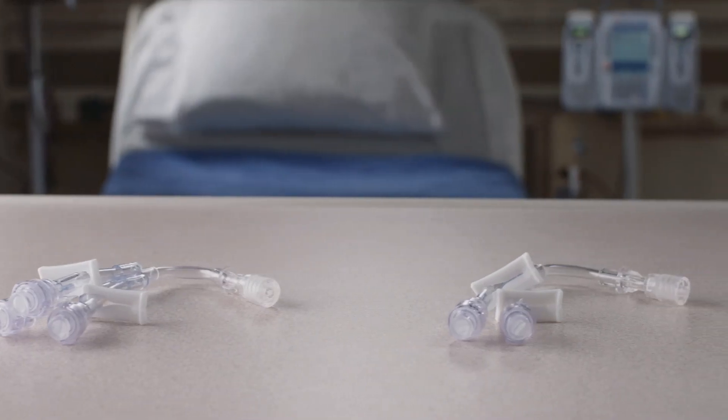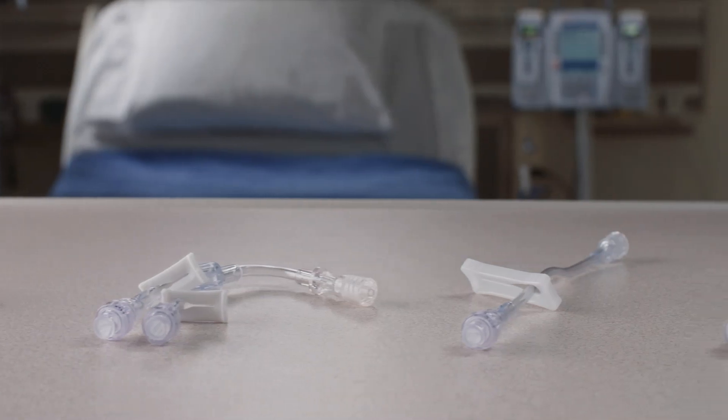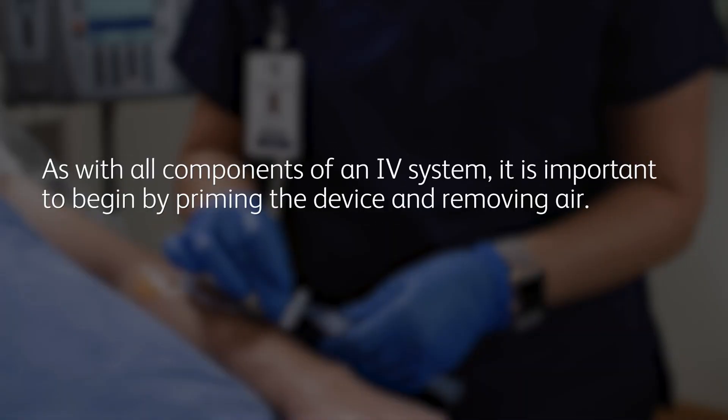This video will demonstrate how to use the BD Q-Site device correctly to take advantage of all its features. As with all components of an IV system, it is important to begin by priming the device and removing air.